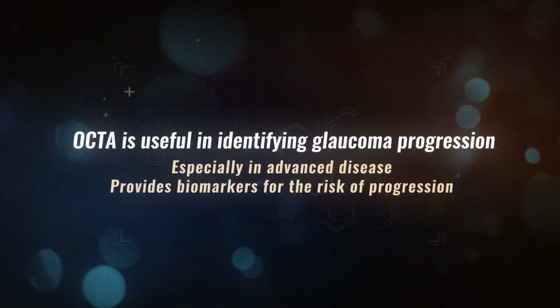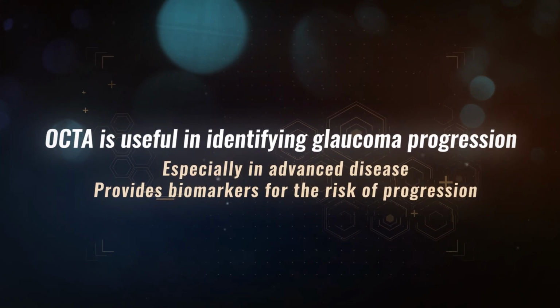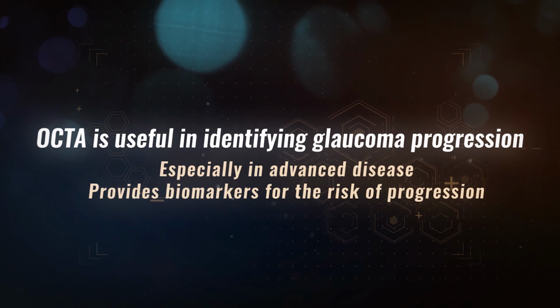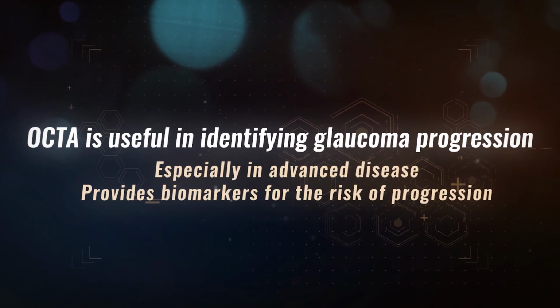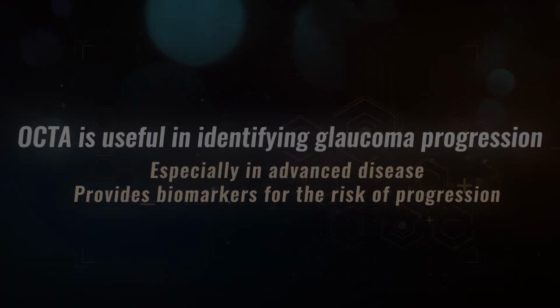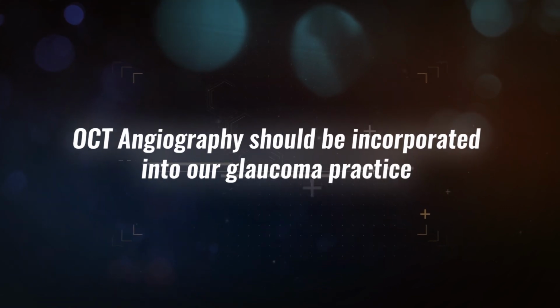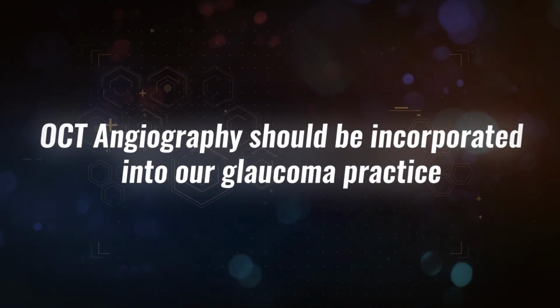OCTA may be useful in identifying glaucoma progression, especially in advanced disease. It also provides biomarkers about the risk of future progression, which can help us appropriately plan the management for our patients. Hence, it is time we start incorporating OCT angiography into our glaucoma practice.